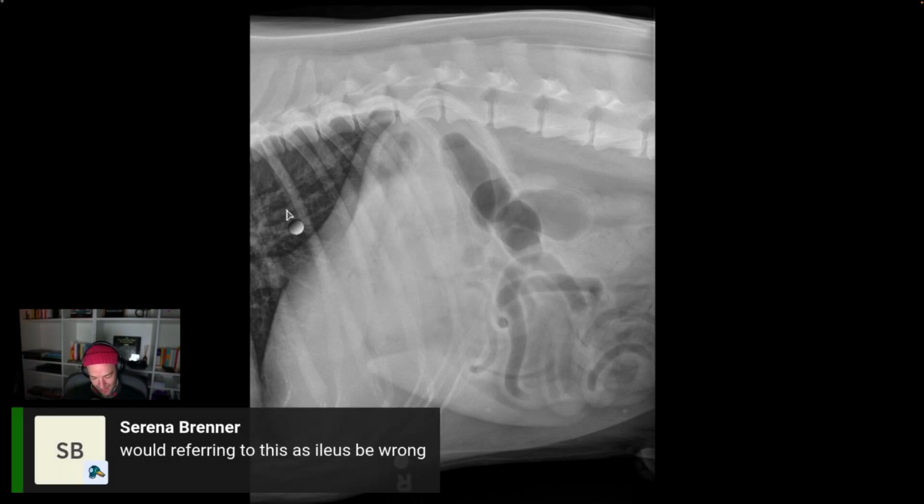This particular case, I would not do follow-up imaging unless the dog was not better in 24 hours after starting supportive care. So I don't think you need to do a repeat RAD. I don't think you need to do an ultrasound now. I just think that if this dog got into something that it shouldn't, or it's got some gastroenterocolitis, you could only do repeat imaging if it's not better in 24 hours.